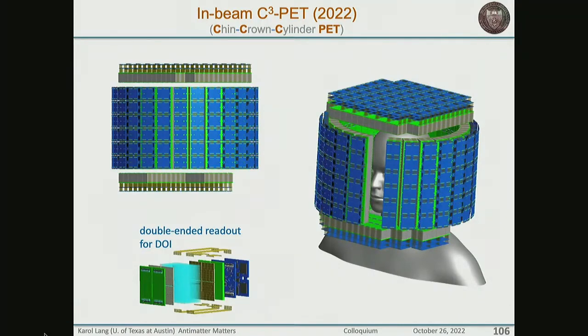And the next NIH proposal would be an in-beam PET, which would have an opening for the beam, and otherwise, as you see, close even more hermetically around the head. We chose the head because everything else requires enormous budgets. I can't imagine a grant to get larger devices built; that's effectively impossible.